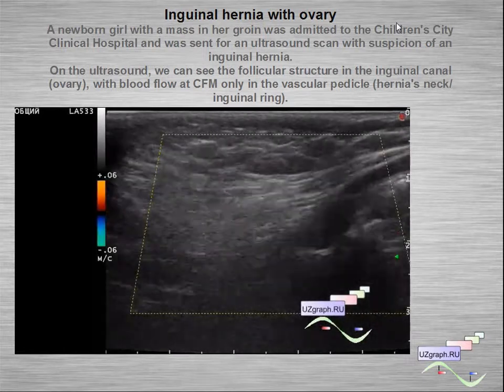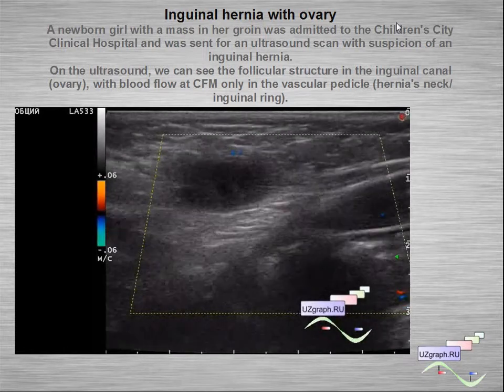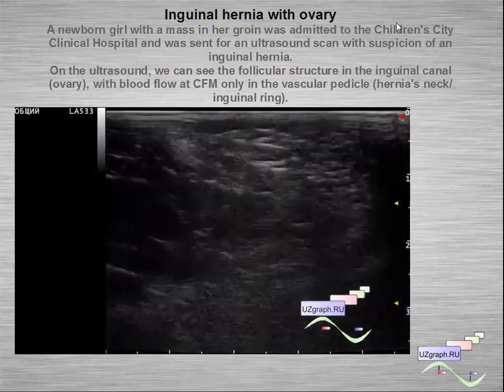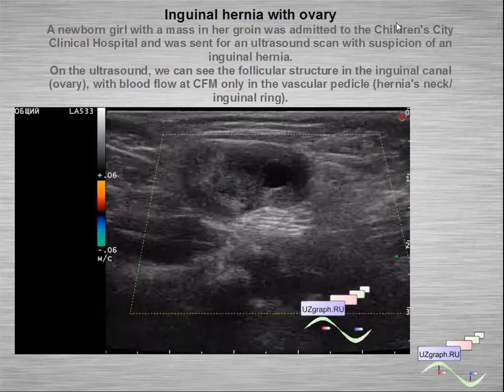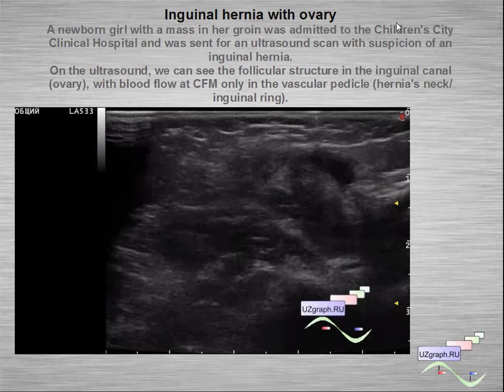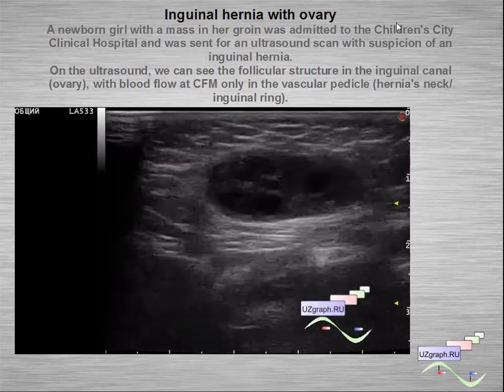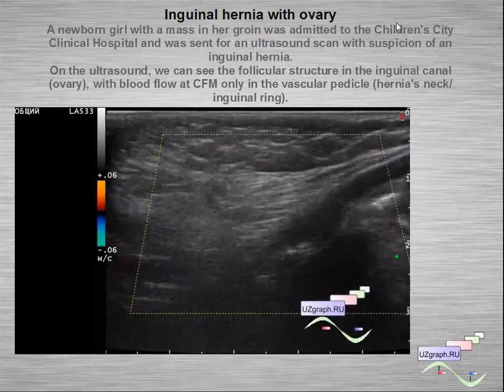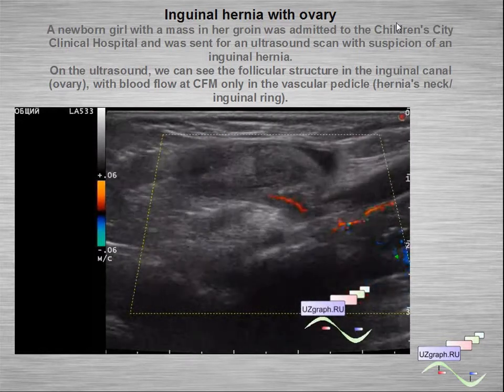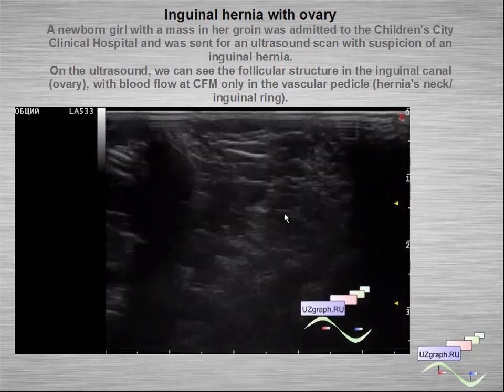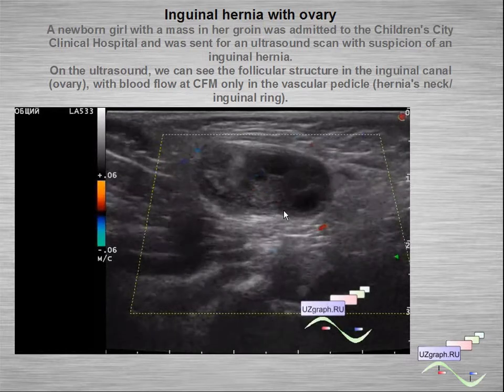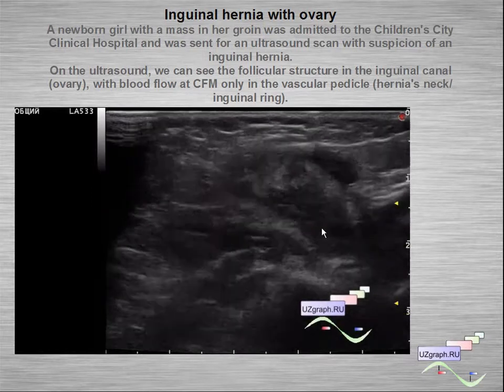In another case of inguinal hernia with an ovary: a newborn girl with a mass in her groin was sent for ultrasound with suspicion of inguinal hernia. On ultrasound we can see a follicular structure in the inguinal canal, with blood flow on color flow mode only in the vascular pedicle at the hernia neck.